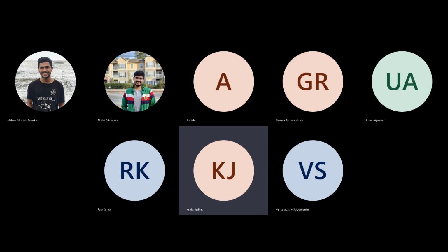Basically, what we are focusing on right now is to go through the coronal sections of the PET images so that we can identify the pixel intensity value in each pixel of a coronal image. And then from there, we will calculate the activity concentration in that pixel. Atharva has been able to extract the pixel intensity value, and now we are looking towards calculating the activity concentration in each pixel, which is given by a particular formula. There are 3 components of this formula.